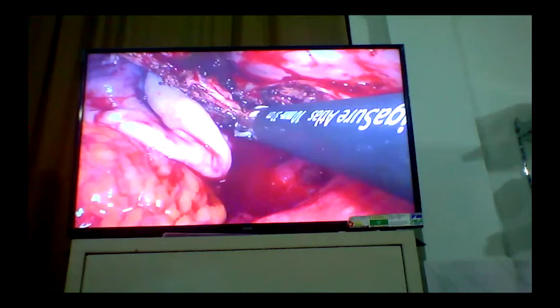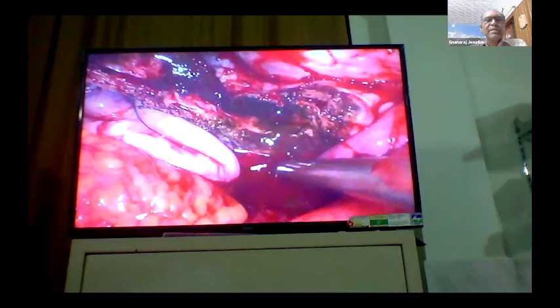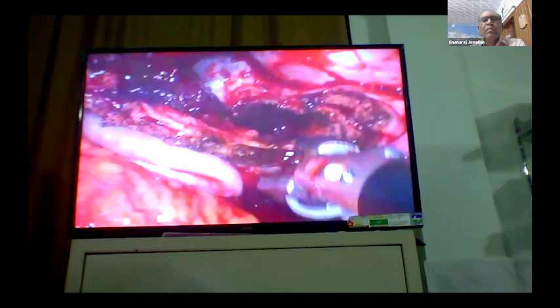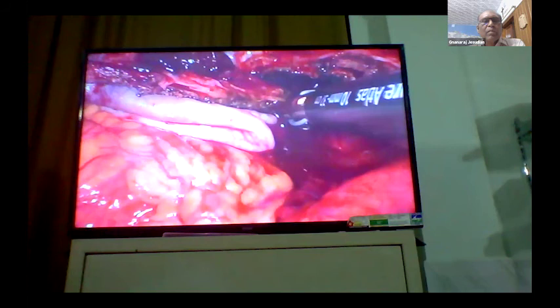One of the important things you need to do when you're doing this is to stay away from the rest of the intestines. Monopolar cautery can be used, but it doesn't seal the vessels, and also the electricity can spread laterally. That is the reason why bipolar or vessel sealing is better. So now he is near the ovarian ligament and he is sealing and dividing it.